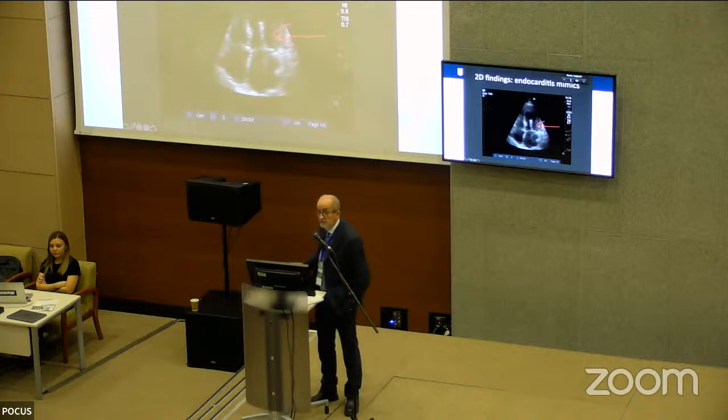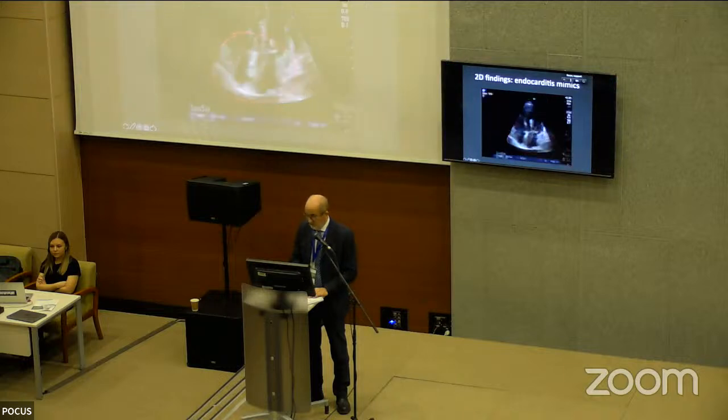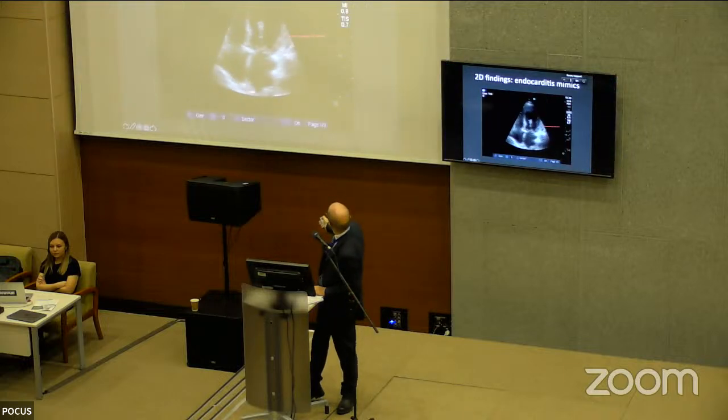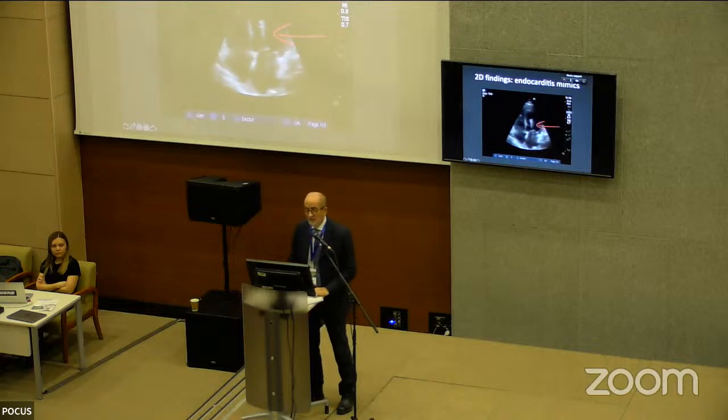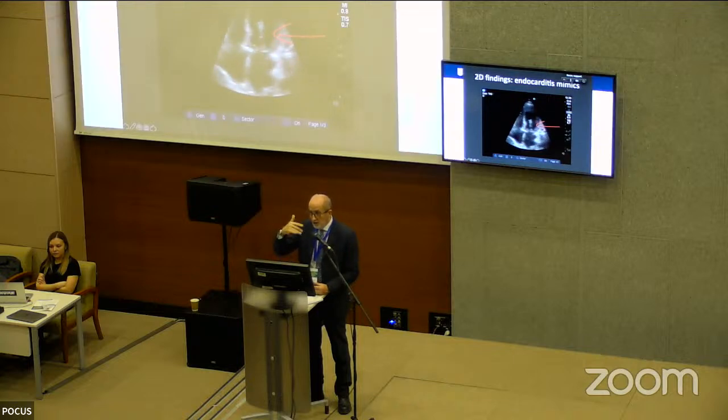What is this? Let's see motion. This one? Is it calcification? Artifact? Maybe. Remember the characteristics of the endocarditis? Mobility, relation with the structure, with the valve. And this echo is linear, is not moving, is not related to the structure. So it's an artifact.